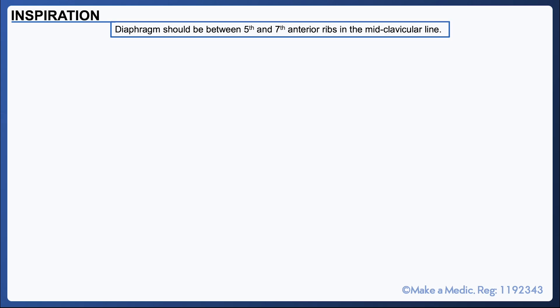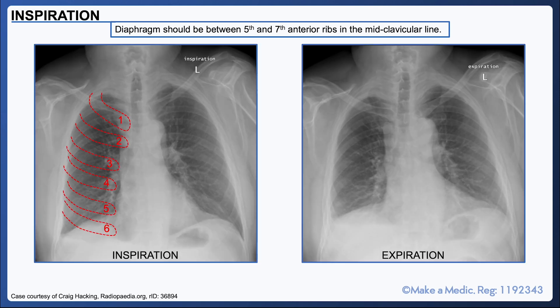Patients are asked to take a deep breath in and hold it when a chest x-ray is being taken, but oftentimes it's much easier said than done. In general, the diaphragm should be at around the level of the fifth to seventh anterior rib in the mid-clavicular line. On the left, we can see six ribs that are visible, whereas on the right, you can only see about four ribs, which makes it harder to evaluate the bases of the lungs.